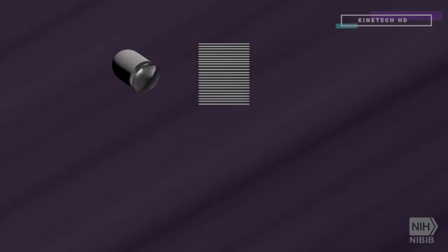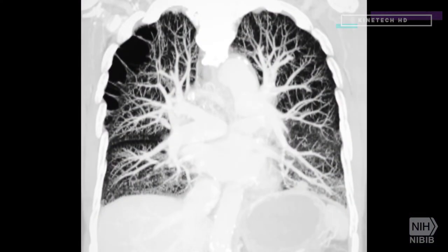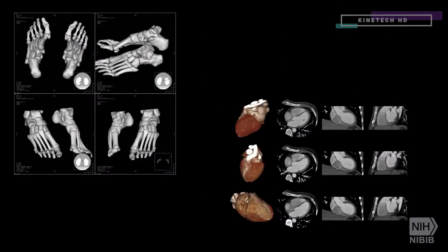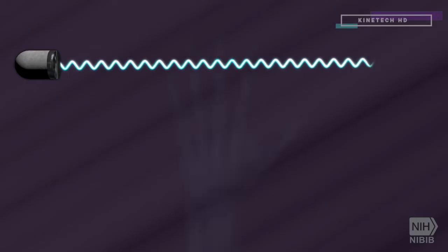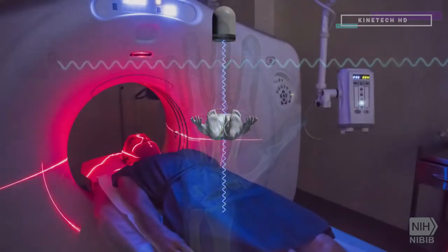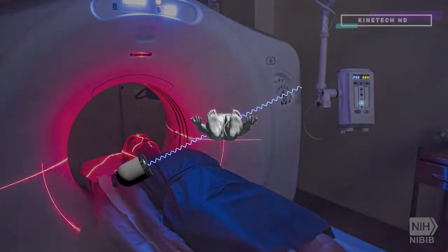A CT scan is an x-ray procedure that creates cross-sectional images with the help of computer processing. CT images are more detailed than conventional x-ray images and can reveal bones as well as soft tissue and organs. A conventional x-ray uses a fixed tube that sends x-rays in only one direction, while a CT scanner uses a motorized x-ray source that shoots narrow beams of x-rays as it rotates around the patient.